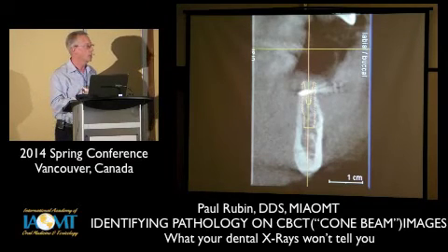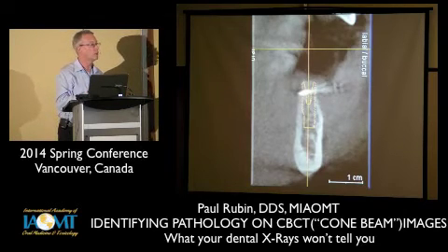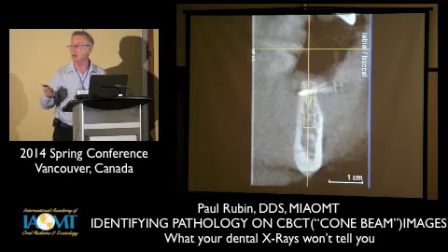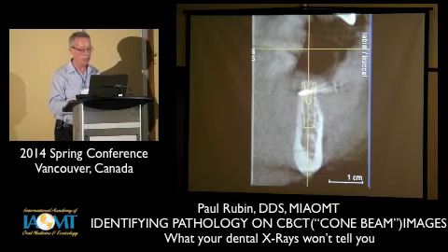Especially on the Sirona system, it's nicely married to the CEREC system, a neat way to build a little surgical guide that will exactly guide your placement of the post hole exactly where you placed it virtually on the screen.